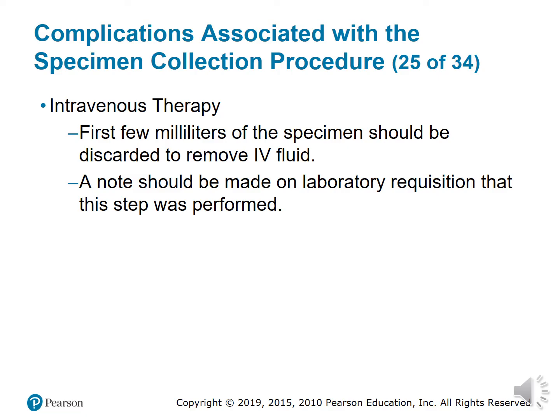If you must draw from the same side as the IV, you must ask the nurse to shut the IV off for at least 2 minutes prior to blood collection, and you must draw below the IV site for less contamination of IV fluids. Also, before collection of blood can be done, you first must draw a waste tube, which is the red tube with no additive. Then the ordered labs can be collected following the correct order of draw specified per site.